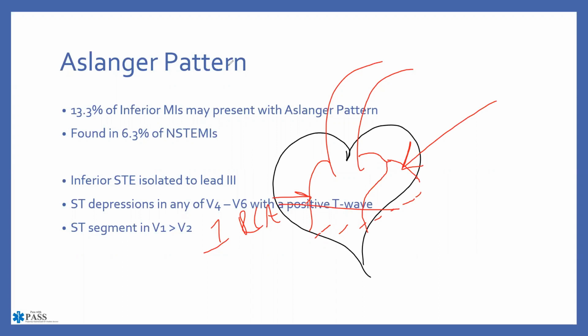So if we do a 12 lead EKG and we find that we have elevation in leads 2, 3, and AVF, we know that we have an inferior wall infarct, but what we do not know is which vessel it came from. Is the problem really up here with this left circumflex, or is the problem actually over here in the right coronary artery? The only way that we're going to be able to determine that is to move V4R over. The easiest way, I should say.